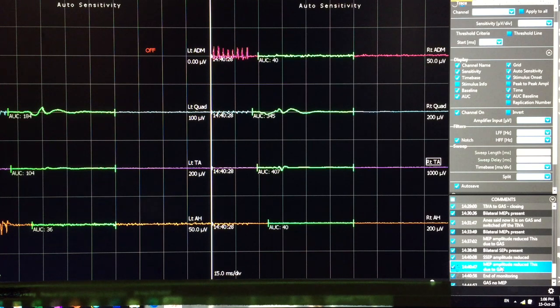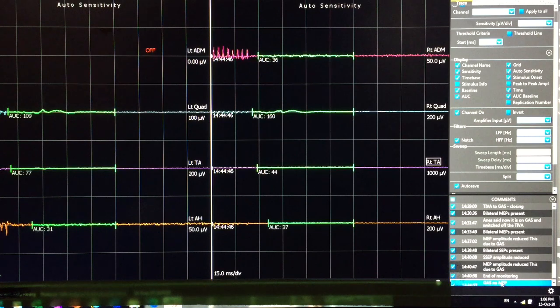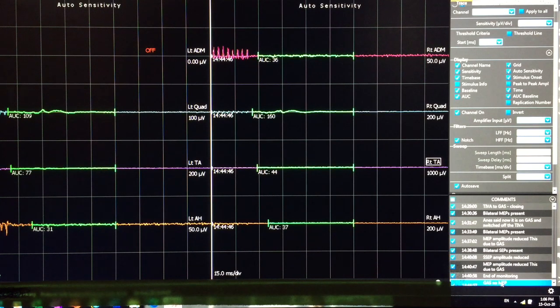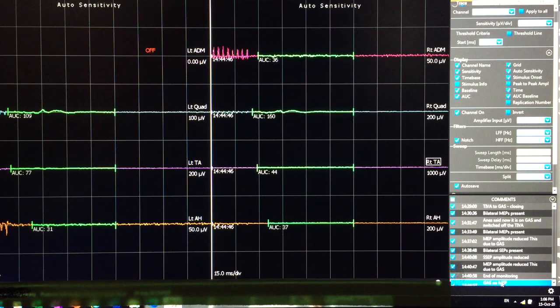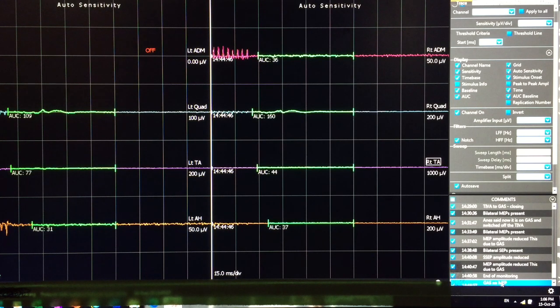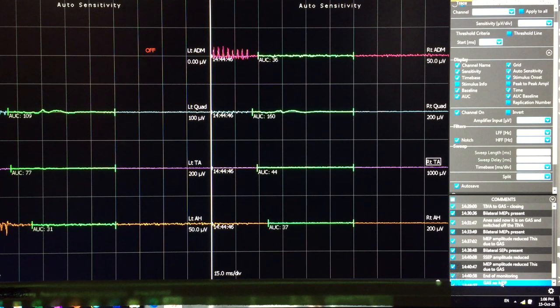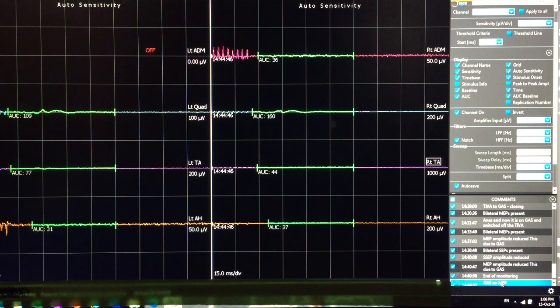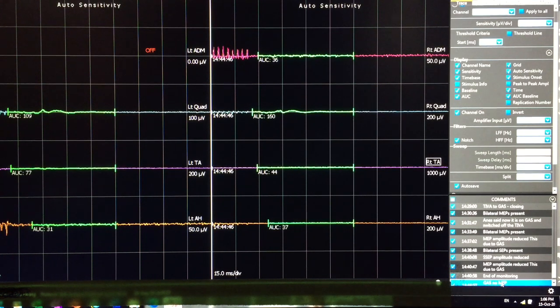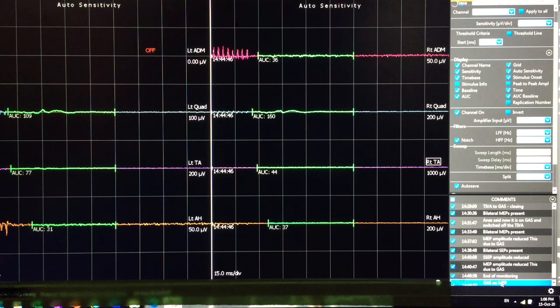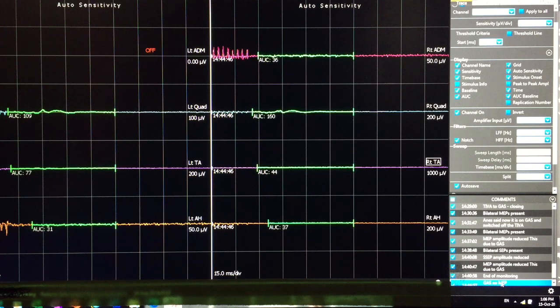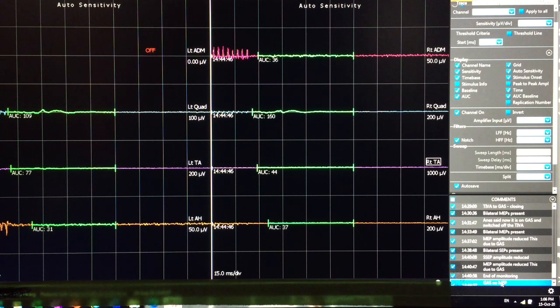1445, that is 15 minutes after switching off the TIVA and put the patient on the gas. There is no response at all.